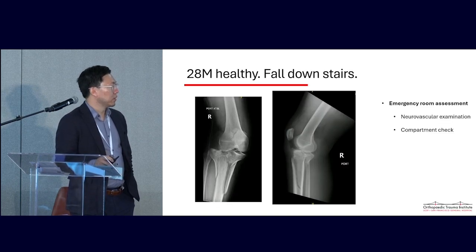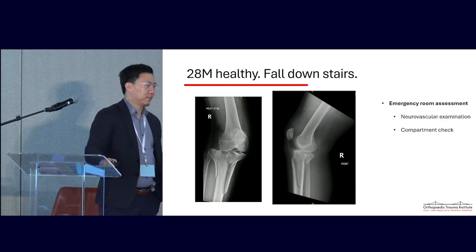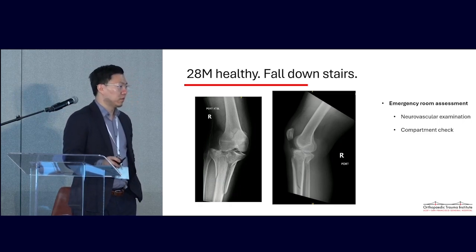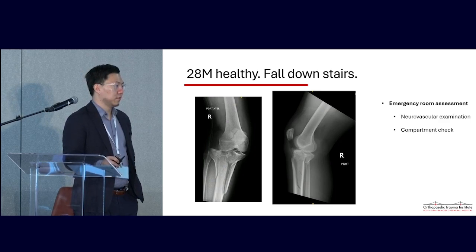Okay, I just have to ask in retrospect, to some degree, your plate acts as the blocking screw. Could you feel like it was really necessary, or do you think you could have just done the nail? For the blocking screws? No, to put the plate on, because you did everything I would have done. I wouldn't have done it through the joint, but I could still do a semi.